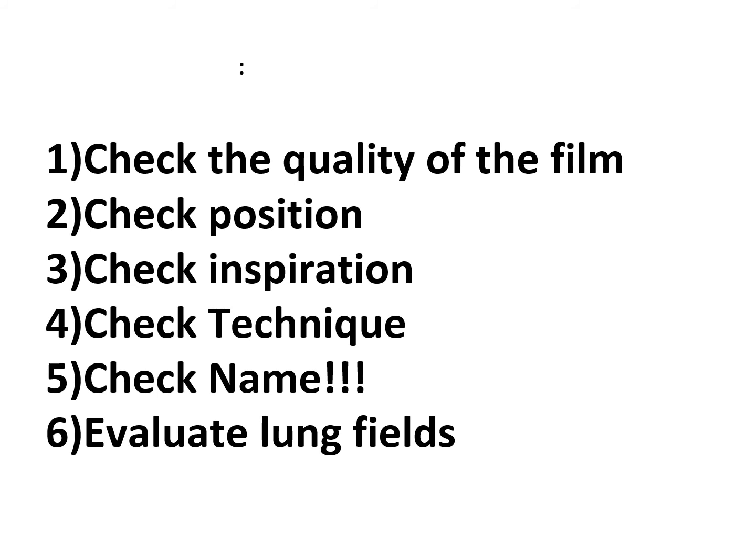The beauty of the technology now with X-rays is that it used to be they would take the picture and then they'd have to take the film physically down to radiology, develop it, and then send the X-ray up. Now everything is digital, and when they're doing an X-ray on those portable machines, a picture comes up immediately on their machine where they can actually see it. You can see the X-ray, so it's pretty cool. So we don't have to wait several minutes for the X-ray to be developed.